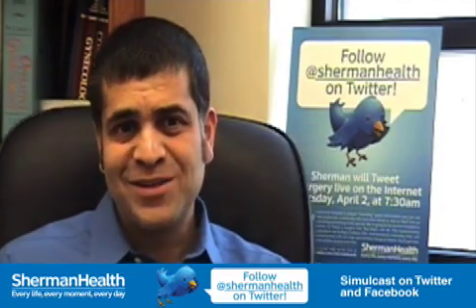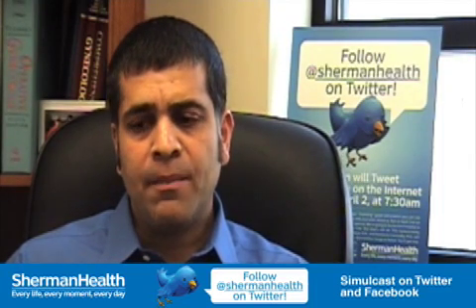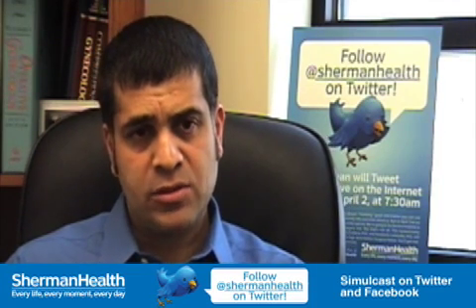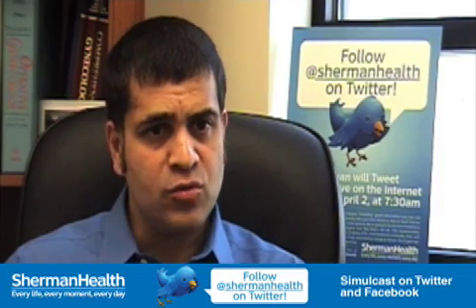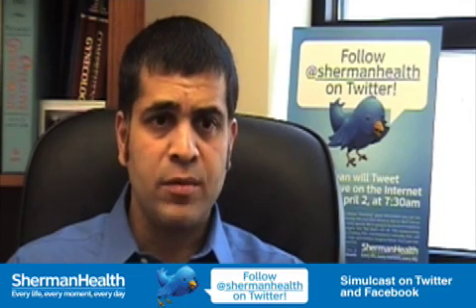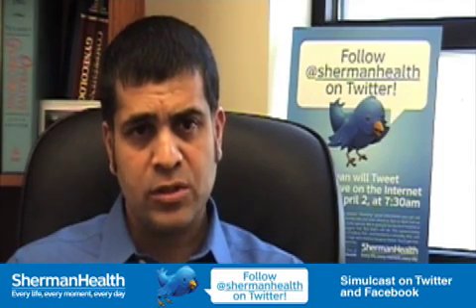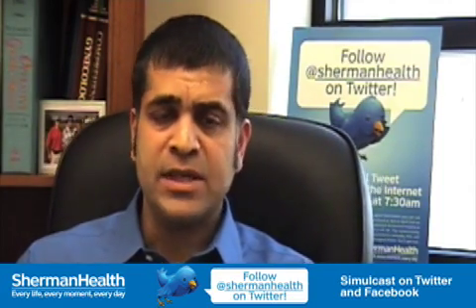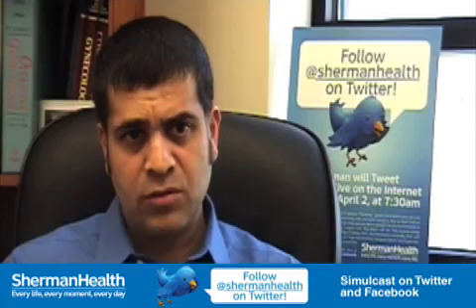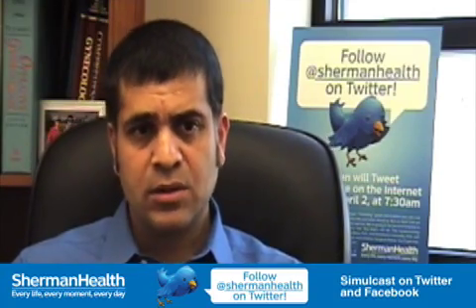Well, it depends whose patient it is. If it's my patient and I'm the primary surgeon, then I'm the one who would be sitting at the robot doing the actual surgery. And he would be the one next to the patient, passing instruments and helping me move things out of the way. Initially, both of us are scrubbed and we go next to the patient, and I would be the one putting in all the instruments in the patient, if it's my patient again. If it's his patient, he would be doing that. And then the one who's the surgeon then breaks scrub, goes to the robot and starts the surgery using the robot, whereas the other doctor just stays next to the patient helping.